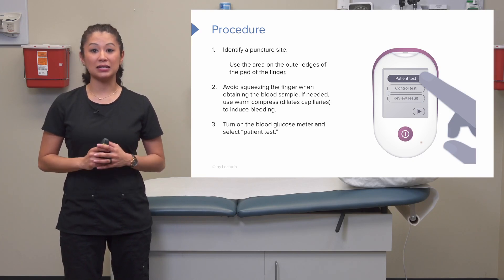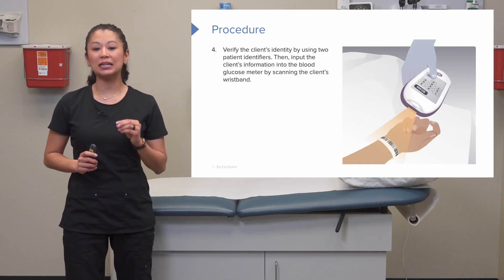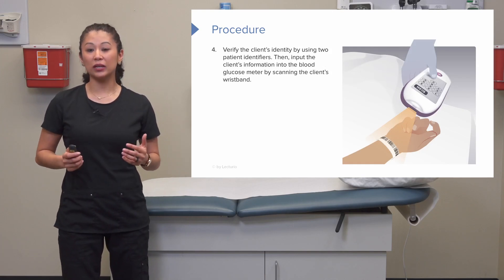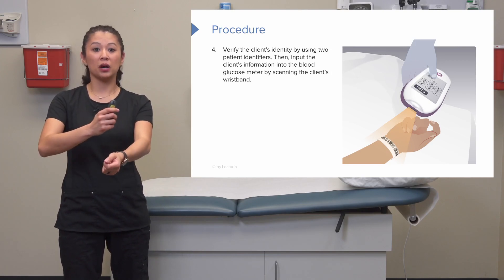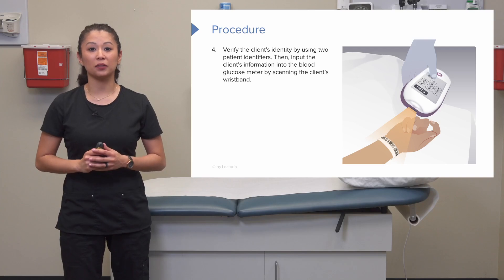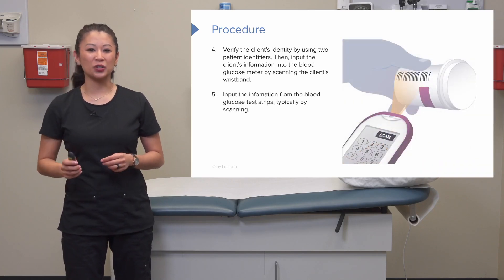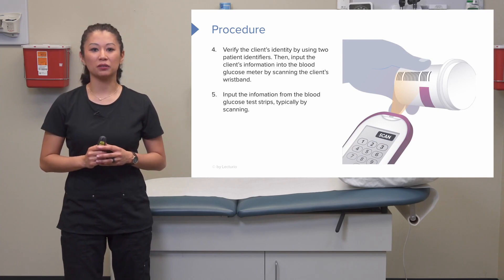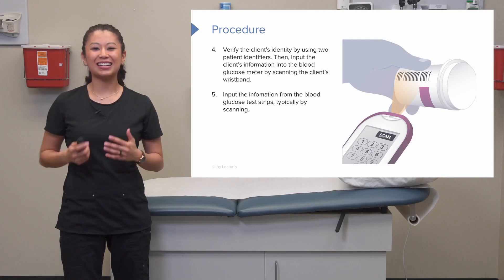Turn on the blood glucose monitor and select the client test option, then input the client's information into the meter. In the hospital, this is typically done by scanning the patient's bracelet with the glucose monitor. Next, input the information from your test strips into the monitor by scanning the strip's barcode with the meter.